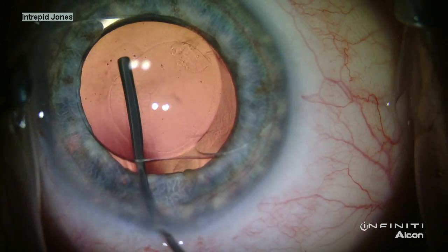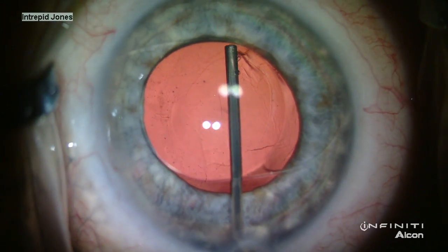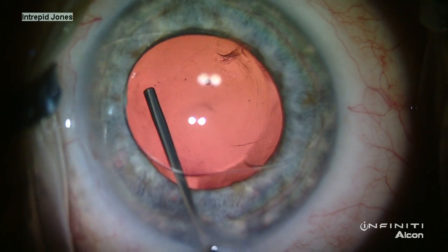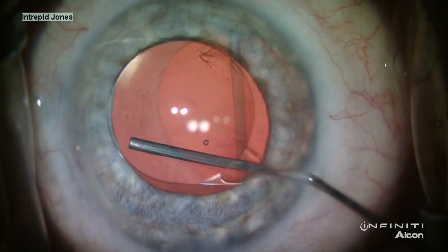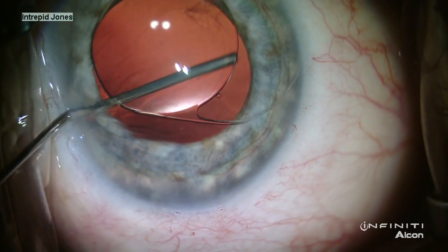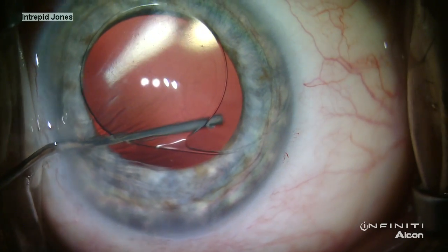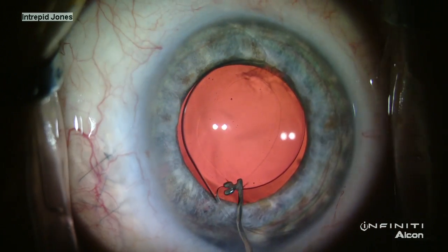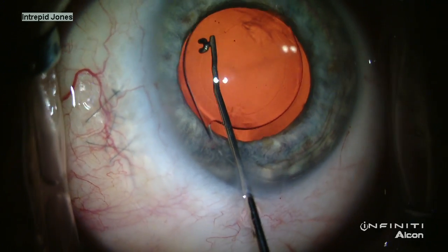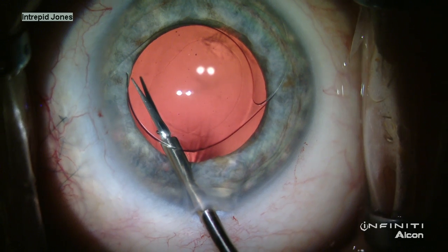Realizing this, my next attention was turned to the capsular bag, and with a puff of viscoelastic, the anterior capsule was liberated from the surface of the posterior capsule, and this opening was extended 360 degrees. Amazingly, after several months, it opened rather easily, and indeed there seemed to be no laxity to the capsular bag.